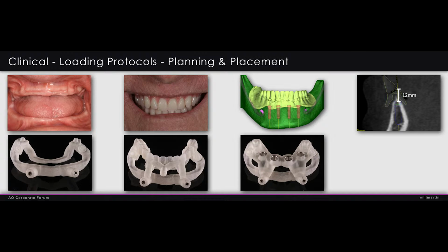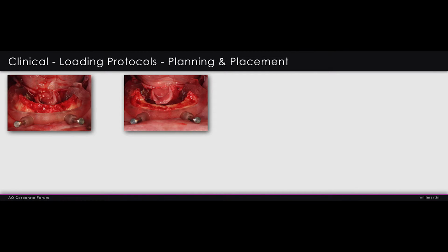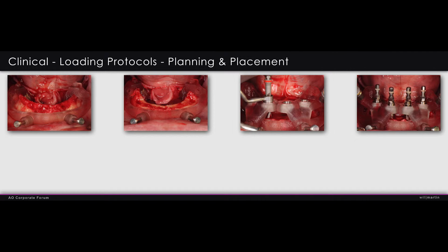This is a pretty neat template. It's a piggyback template. So this is actually what goes onto the bone. This is used to seat it, and this is used to place the implants. And then this right here is going to dictate our bone reduction. So here you see the patient actually using his upper denture now to bite the template into place, and then we do these lateral bone pins to hold it stable. So now we have the bone pins in place, the template's stable, we pull off that seating jig, and we're going to remove this bone here.